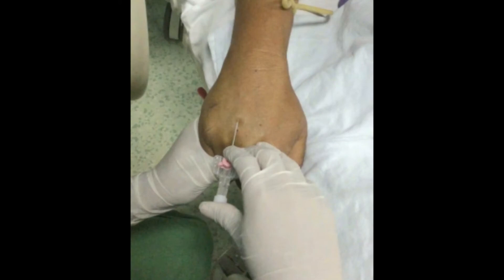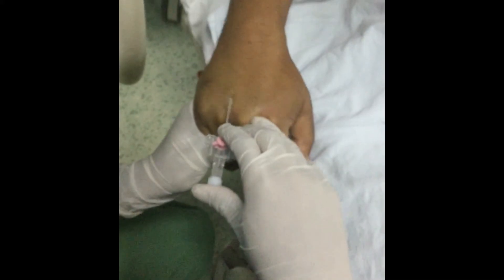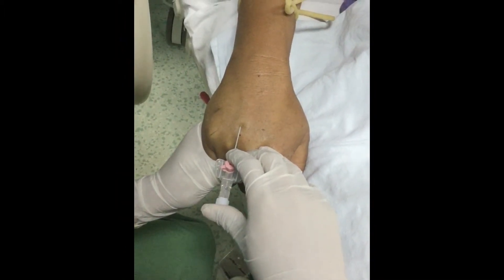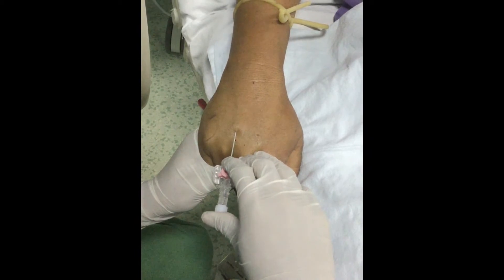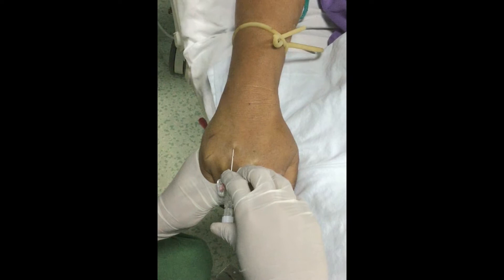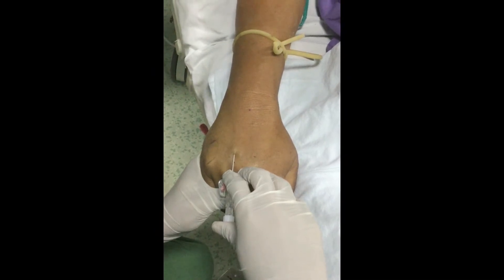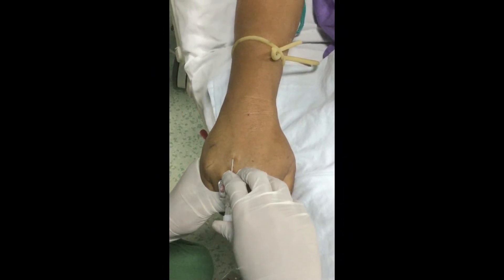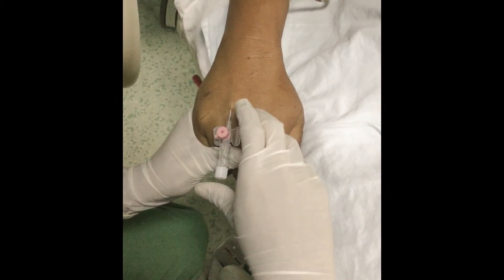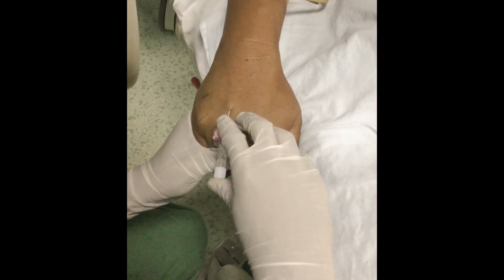Grasp the catheter wings with the first and middle fingers of the hand and support the catheter at the back with the thumb. Hold the needle bevel up at an angle of 5 to 25 degrees depending on the depth of the vein. Then pierce the skin and decrease the angle of the needle further until nearly parallel with the skin.